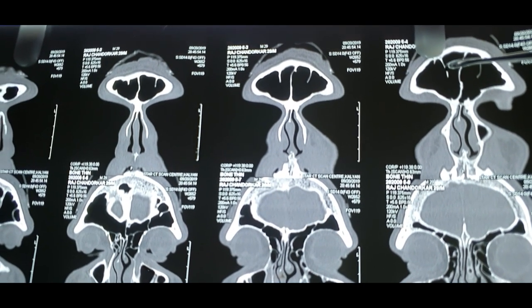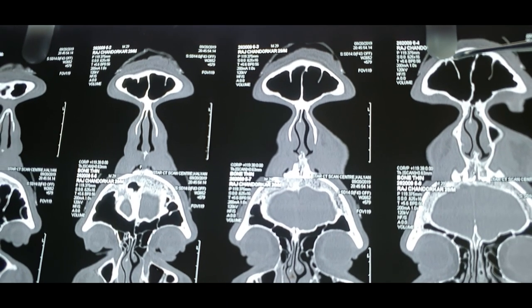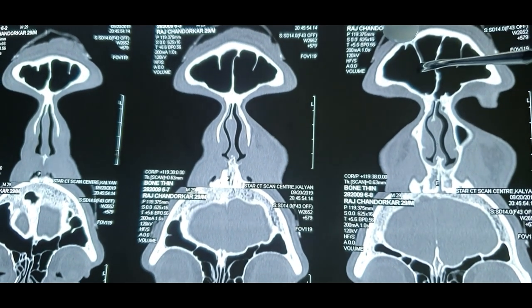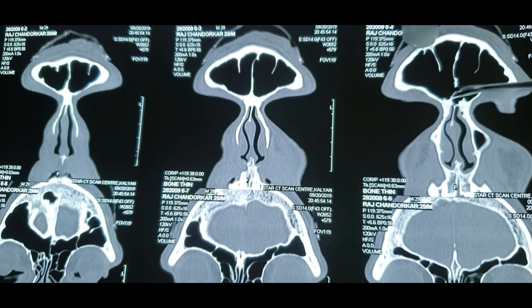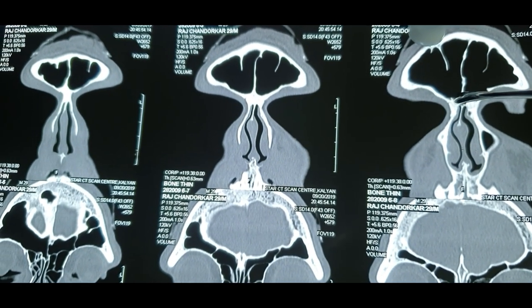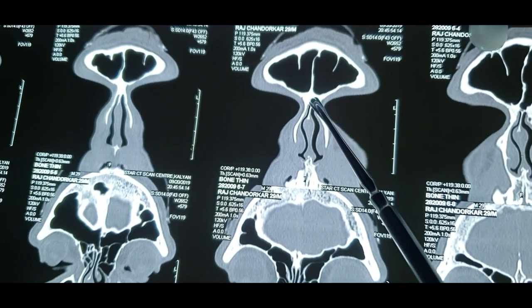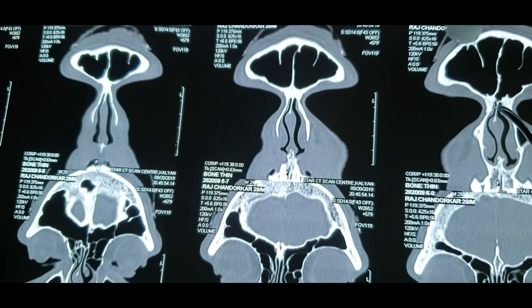So when you see this intrasinus septa, these are thick and attached firmly to the sinus wall over here. So these are typical of a sinus, mostly seen in the frontal region. So this is the right, this is the left, this is the interfrontal sinus septa, this is the intrasinus septa, which is incomplete, not complete. And as you go, see, now the nasal bone has disappeared. In all these three scans, you could see the nasal bone over here and the frontal beak above. So you see there is no nasal bone whatsoever here.